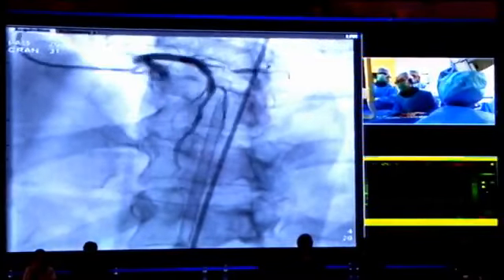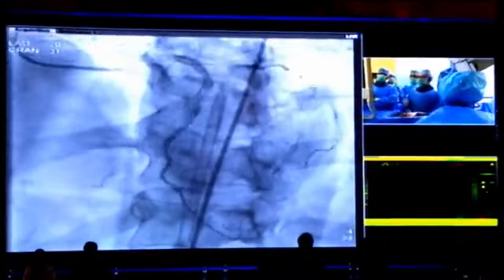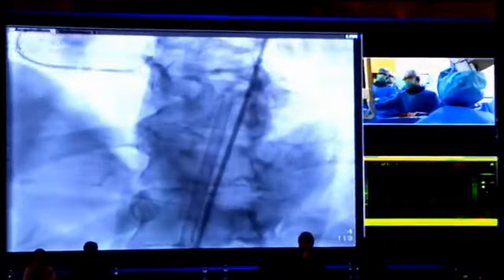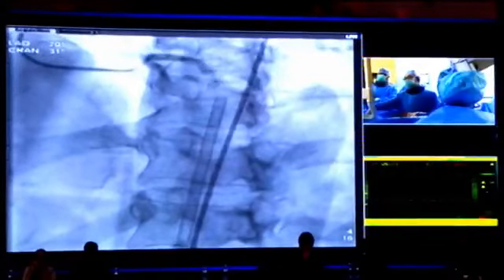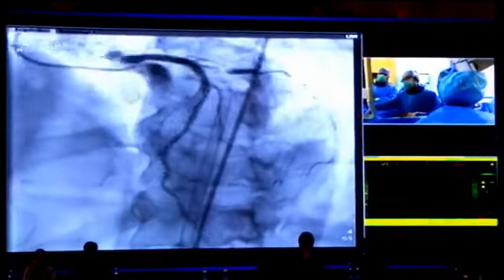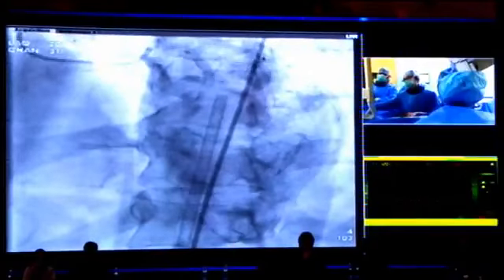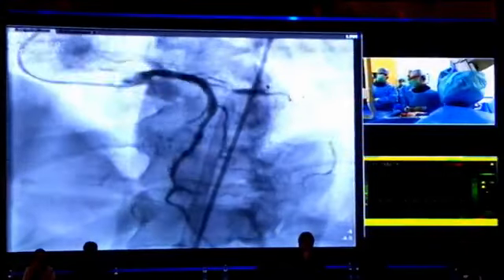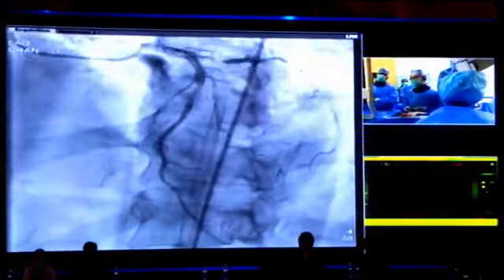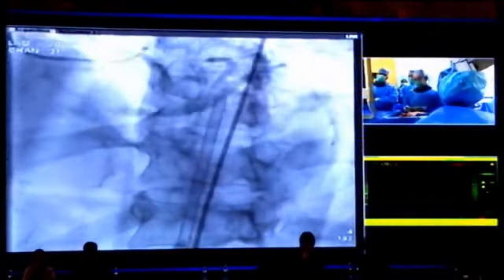Unfortunately, these channels include very tight bending parts. Another important piece of information is that we can see the vessel moving with the heart beating. So this channel is very difficult to use for retrograde PCI, and the risk of perforation is very high.